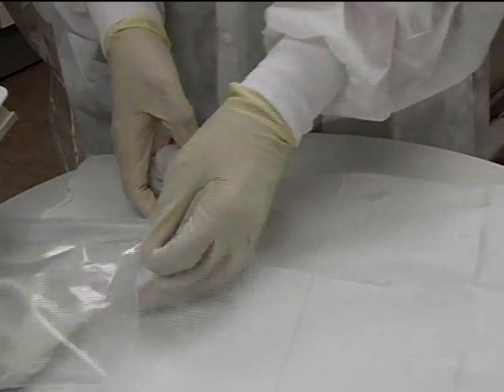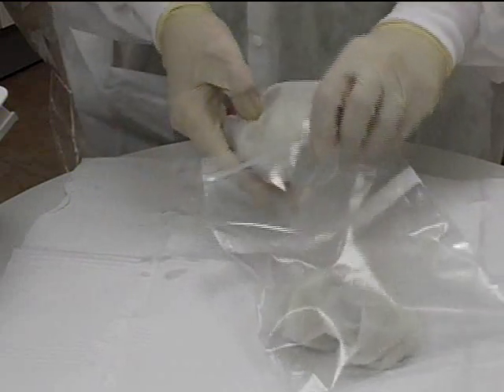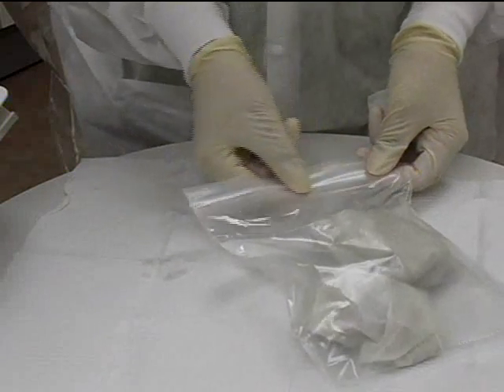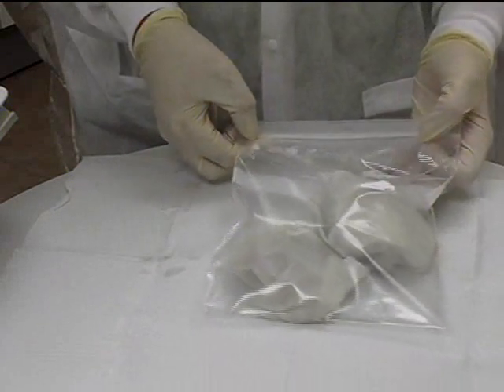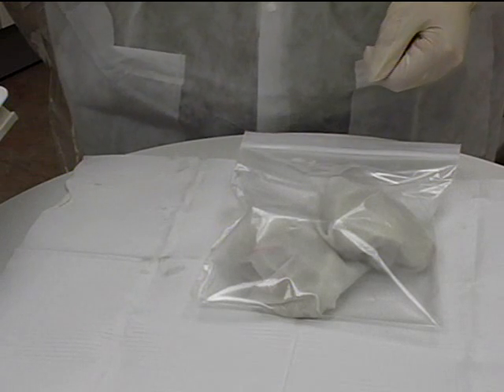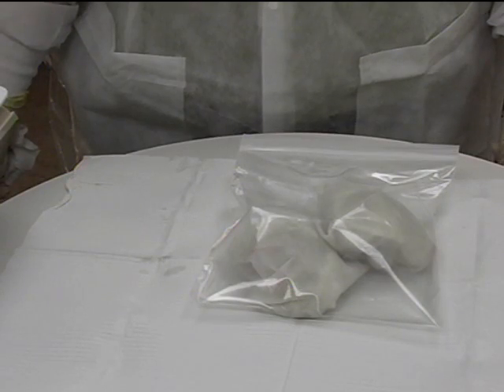Be sure to place the impression in a plastic bag for transportation to the laboratory. Again, storing the impression in either a wet or dry environment will cause a gain or loss of water, resulting in distortion of the impression. Ideally, the impression should be poured with stone within 12 minutes after removal from the mouth.